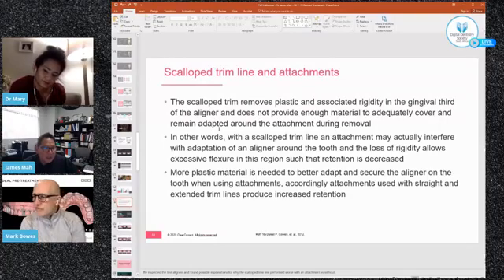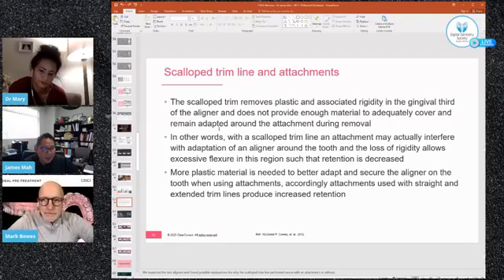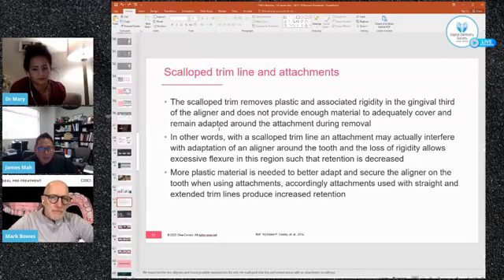Of course, we do our complete periodontal exam and clinical exam. And at the university, we do take cone beam CT scans on everybody. And we have a good look. But again, it underscores that there's some complexity to aligners. It's not so straightforward.